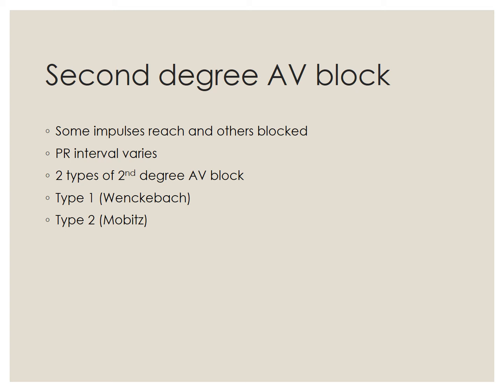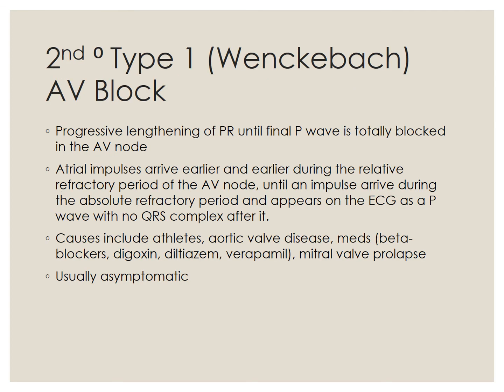And if I didn't confuse you enough as it is, there are two second degree AV blocks. We've got type 1 and type 2. Second degree type 1, also known as Wenckebach. I'm assuming that is the dude who discovered this.